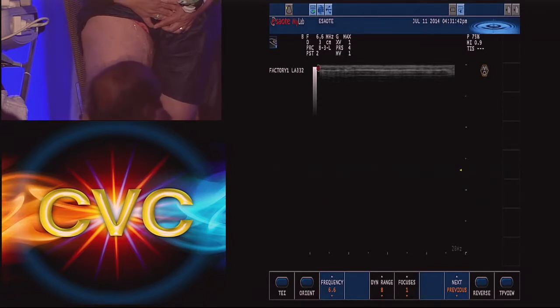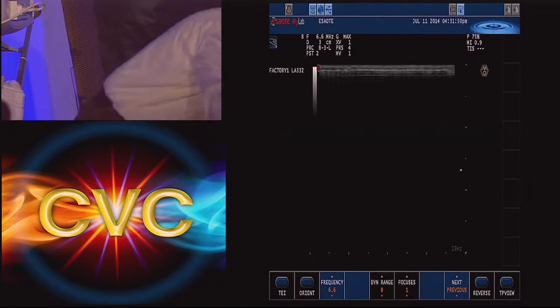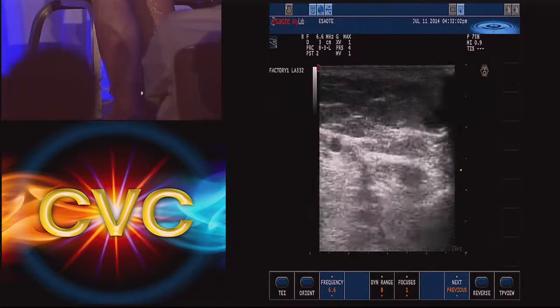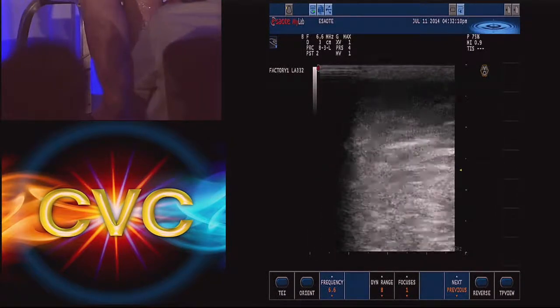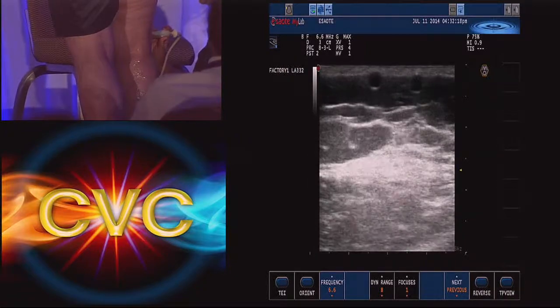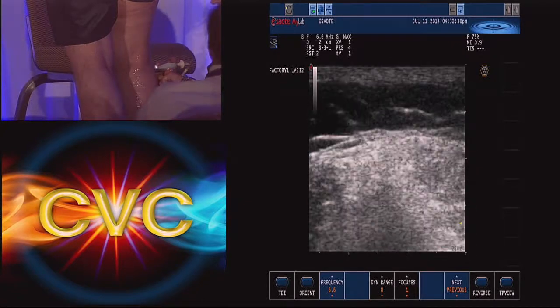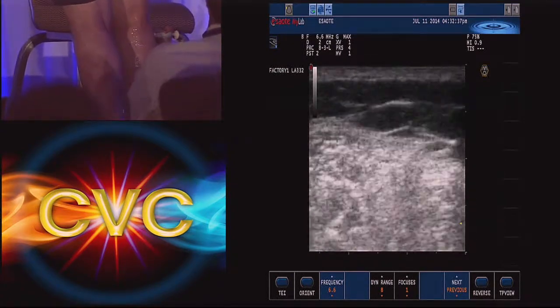Can you see if there's a perforator down here? Anywhere along the path. Just lower down a little bit here. Thank you. No. And then you spread it back in. And watch that. She just showed you this branch going in, lower down. Could you do it for the branch that we followed down all the way, from that anterolateral branch? Yep. Follow it down. Watch those branches. So you have to be patient and just follow the branch. It's like Braille. Sometimes you close your eyes and just feel the vessel go down all the way, and then you see where it's going, and then put your ultrasound on it.